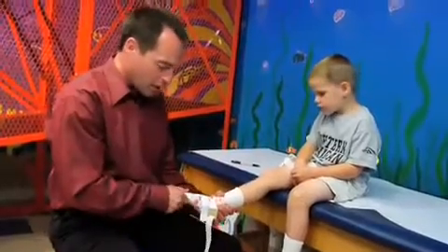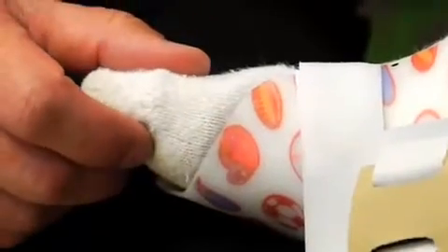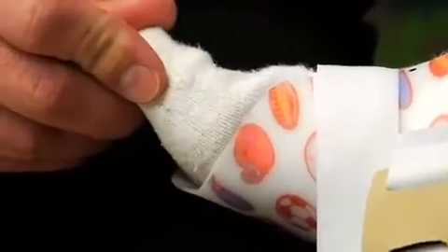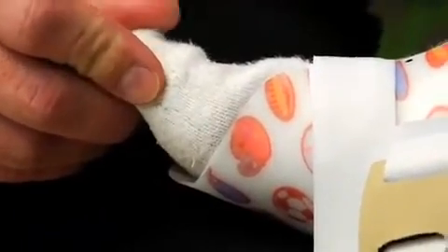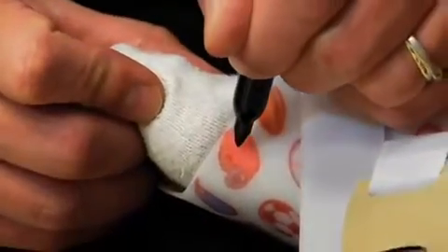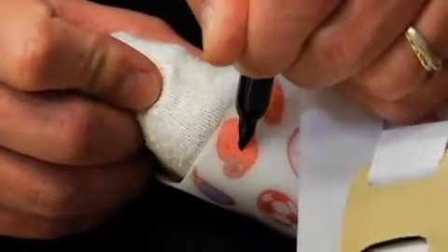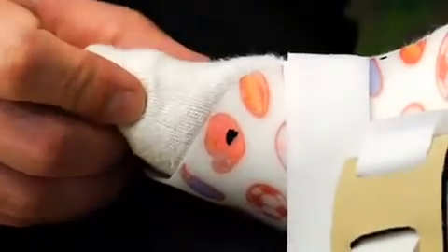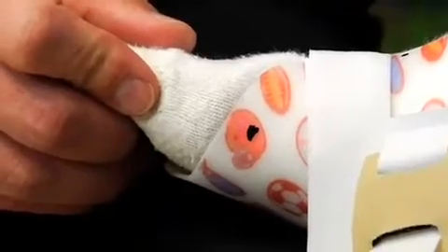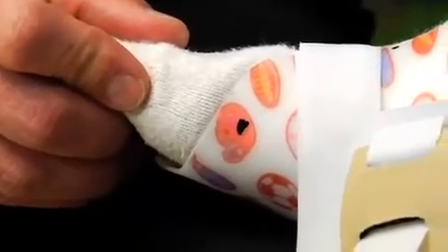Next we're going to check our trim lines. In Kyle's case, we can see that it's impinging on the proximal aspect of the metatarsal head. You can simply mark where you want to trim the orthosis back to ensure that it is behind the metatarsal head and not going to impinge on the proximal aspect of that metatarsal head.